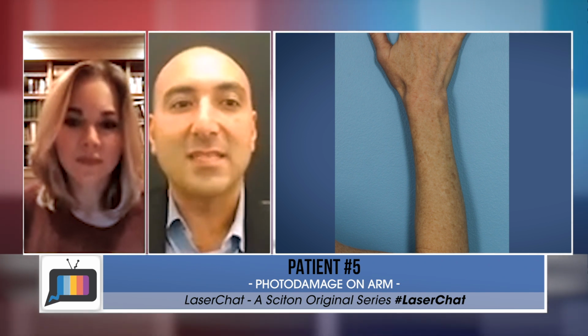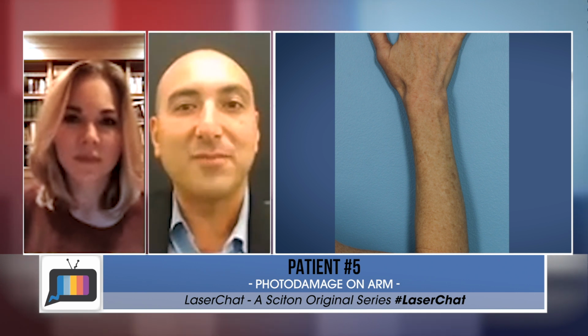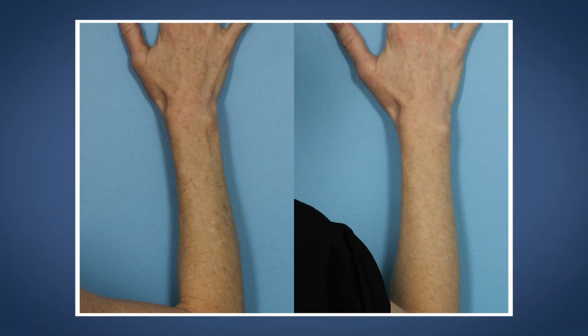You may or may not get improvement in those macular SKs. And really, if you want to get those totally gone, you might have to come in with the erbium single spot handpiece at a very, very superficial depth and just erase them with very, very superficial ablation. Okay, so let's see before and after.